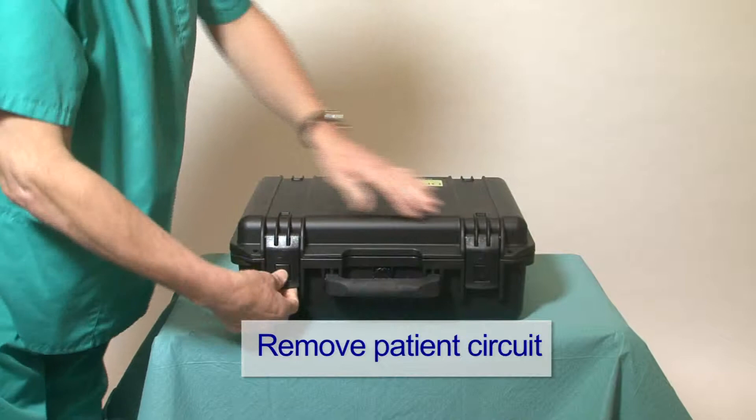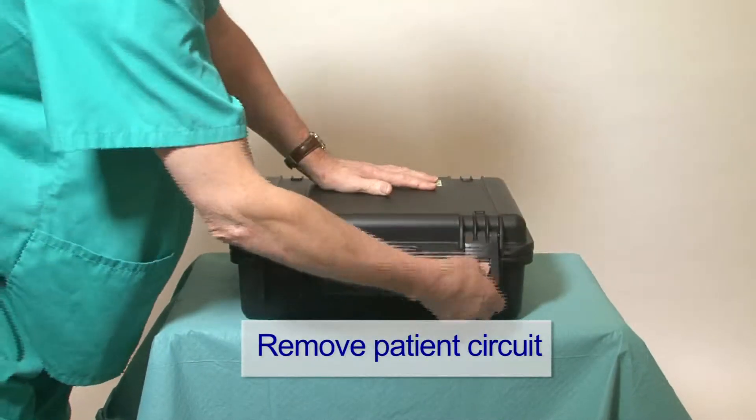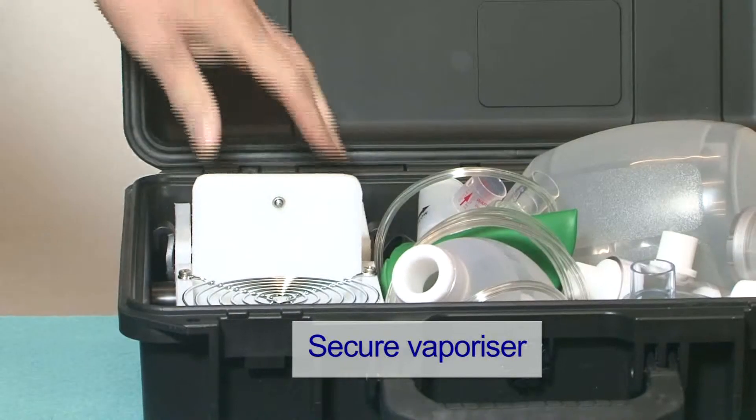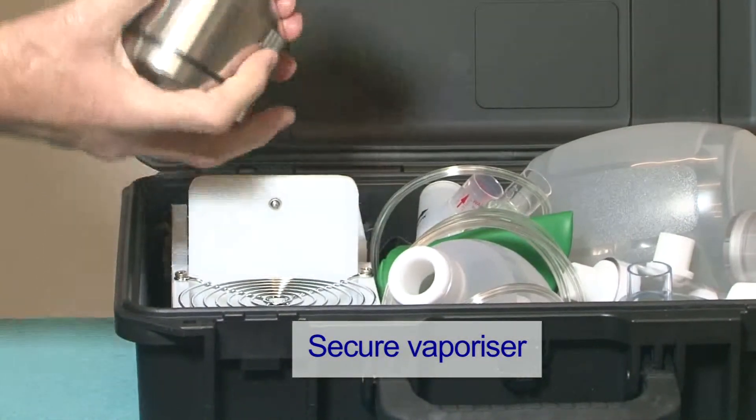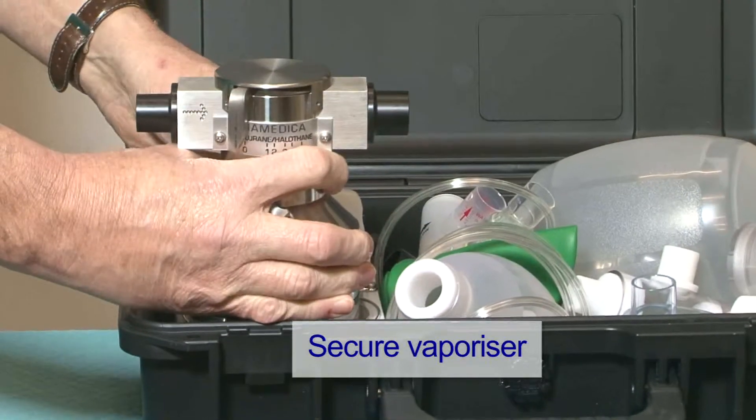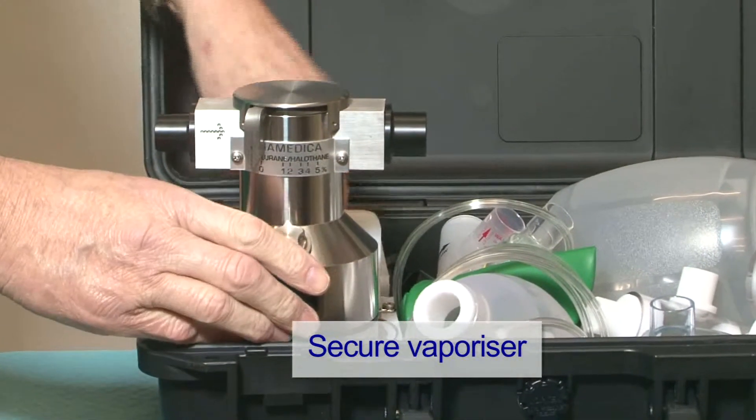Open the case and remove the patient circuit. Undo the retaining strap from the vaporizer, take out the vaporizer and secure it to the support stand with the screw behind the support stand.